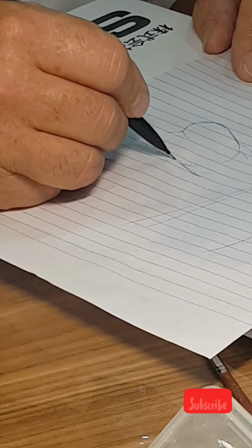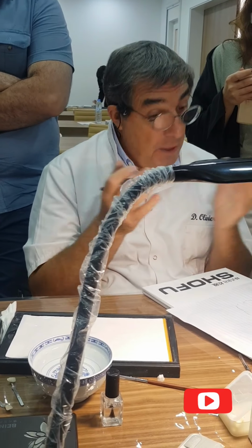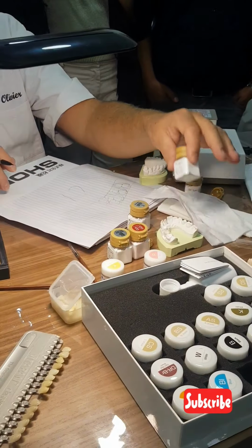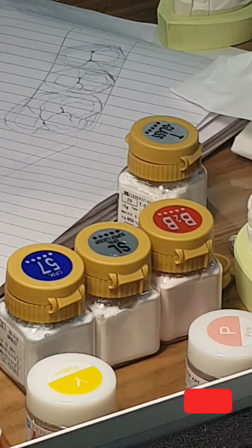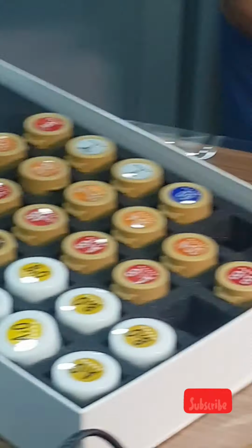So, product, what do I need for that? I can do a beautiful crown in 2 layers. Or if I want it perfect, I include translucency. And again, dentine, translucent, enamel. What I am going to do now, for the root, is an A3 shade. A3 to change. A3 shade.